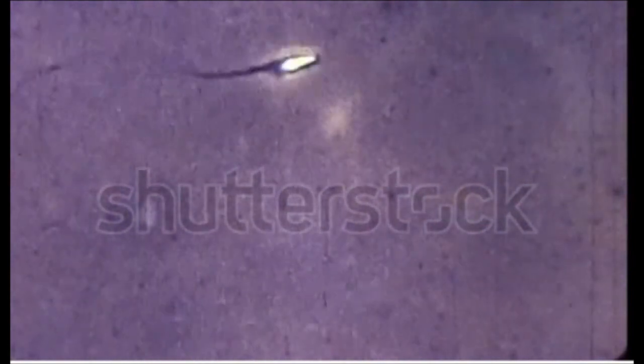Here you will see a slowly progressive sperm. It is definitely moving in a circle or in a linear way, but the distance traveled from one end to the other is less than 25 micrometers, or half of the tail length. The distance is covered, but it is moving slowly. So this is the slowly progressive category. Here you can see some sperms that are totally immobile, they are just not moving. These are called immotile sperms.